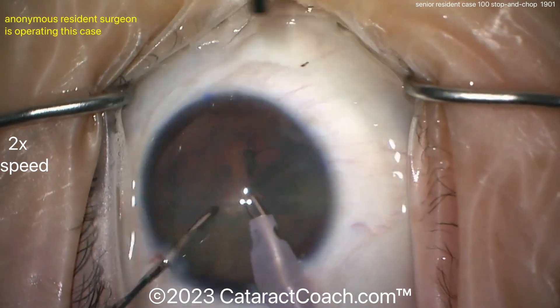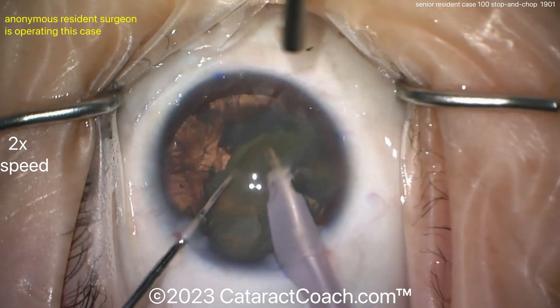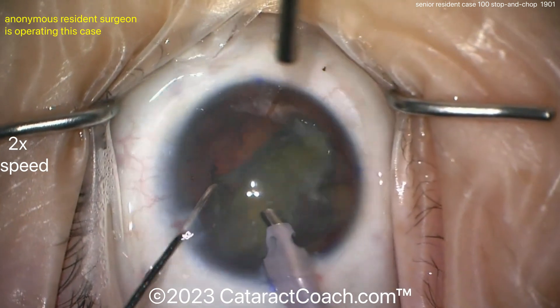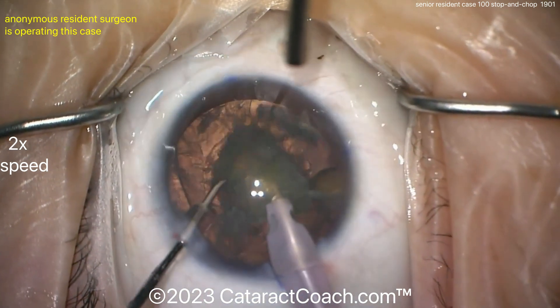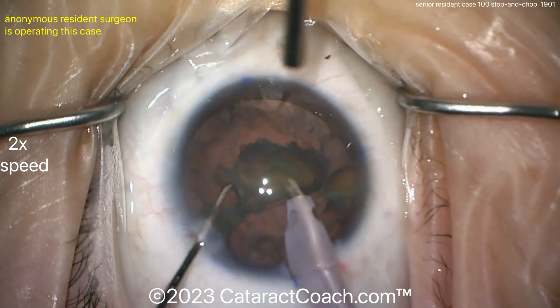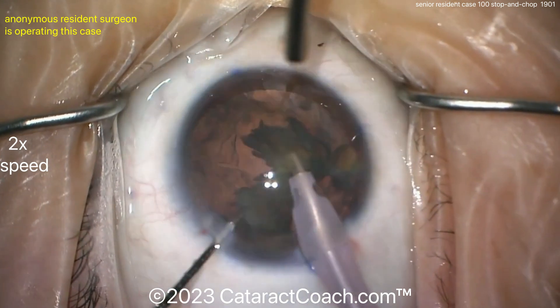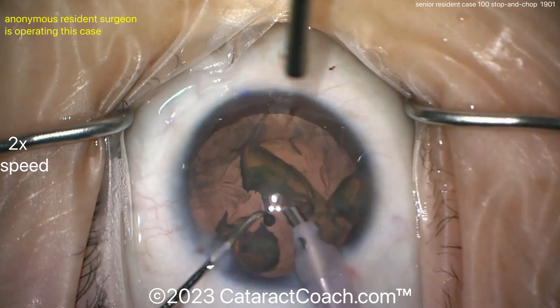By the way, the draping is really good — eye is nicely positioned, set up well in the scope. The video is in focus, and we always love to show videos that are in focus. A lot of young doctors send videos in for us to review and they're all out of focus — any time it's out of focus, we hit that delete button. We won't watch a blurry video.